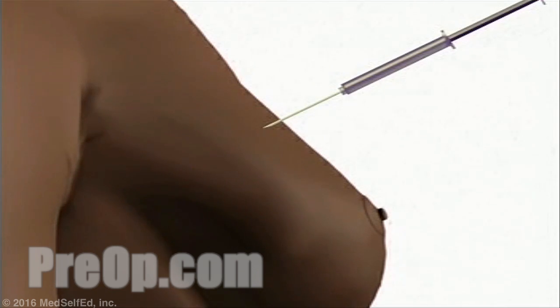This will sting a bit, but your breast will quickly begin to feel numb. Usually, the surgeon will inject more than one spot in order to make sure that the entire area is thoroughly numb.